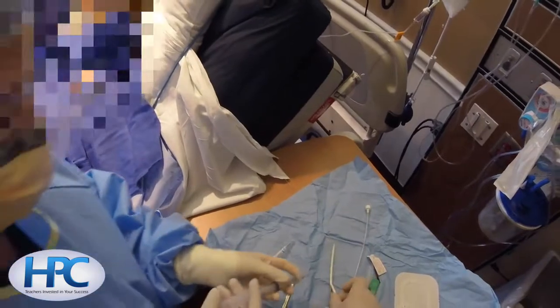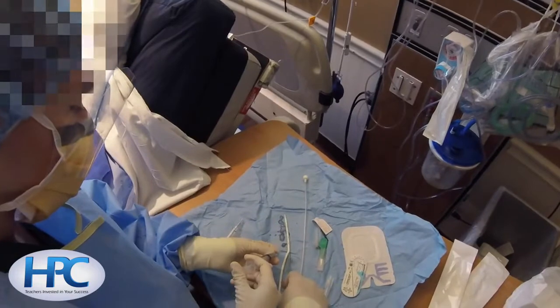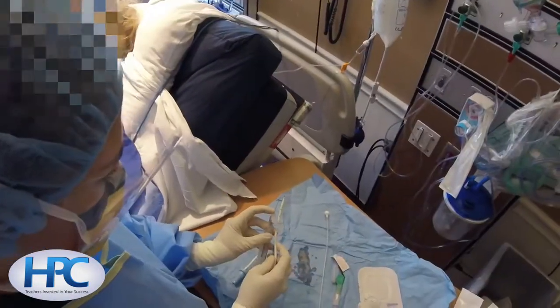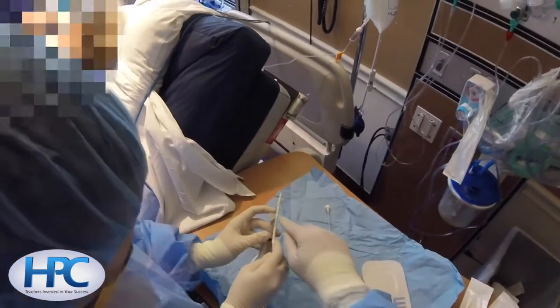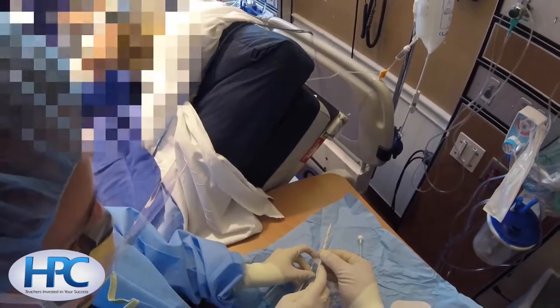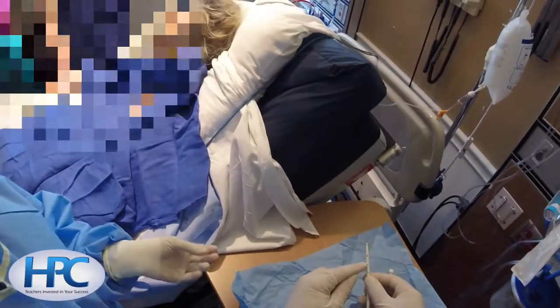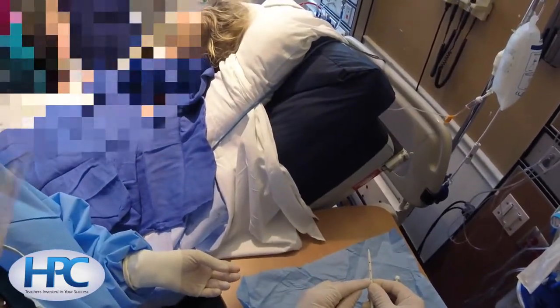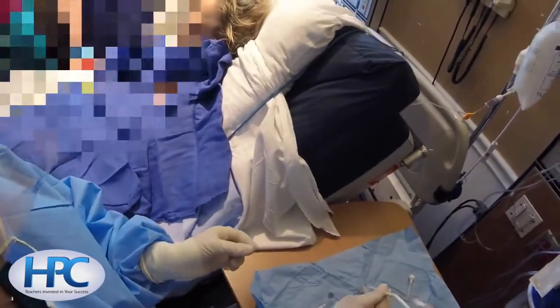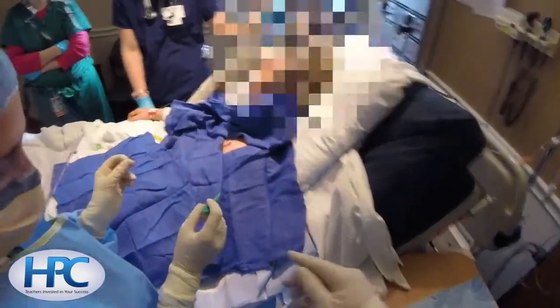We will now use a little bit of the 1% lidocaine to moisten the catheter, which allows it to pass through the subcutaneous tissue easier without any friction. We're using the needle with the appropriate depth of insertion to determine which of the holes along the side of the catheter corresponds to the depth of insertion, and then we will go 1 centimeter beyond that to determine our depth of insertion of the pigtail catheter.